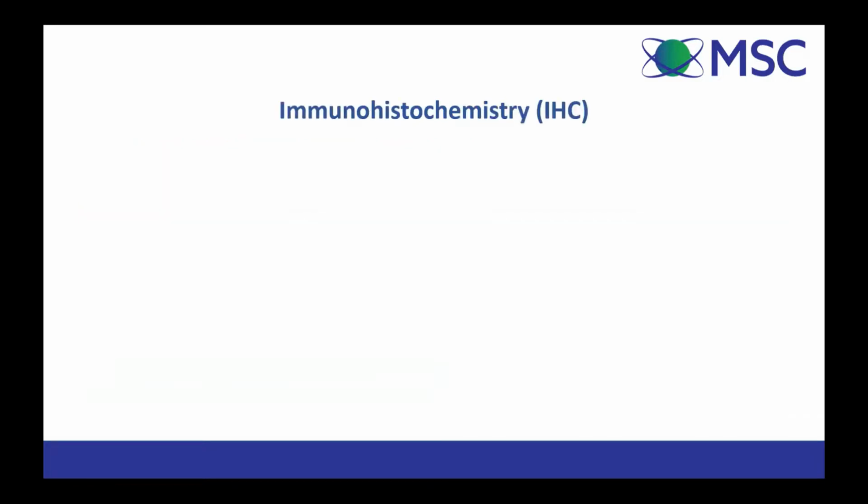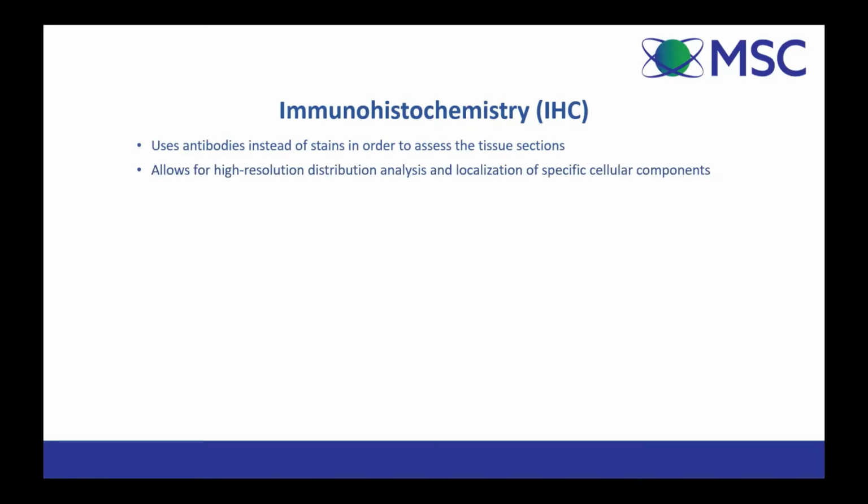So a second consideration is immunohistochemistry. This is done instead of staining with a chemical dye. And this is really a huge topic in itself, so we can host another session on that maybe sometime. But this uses antibodies instead of stains in order to assess your tissue sections. And this allows for high resolution distribution analysis and localization of specific cellular components.